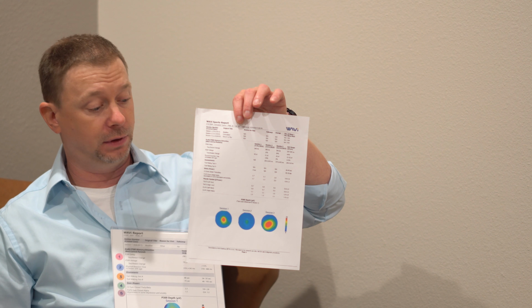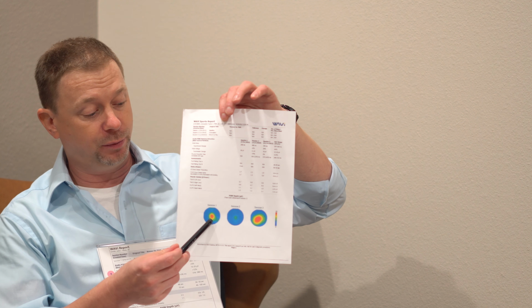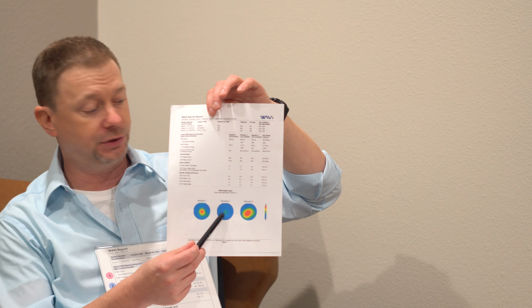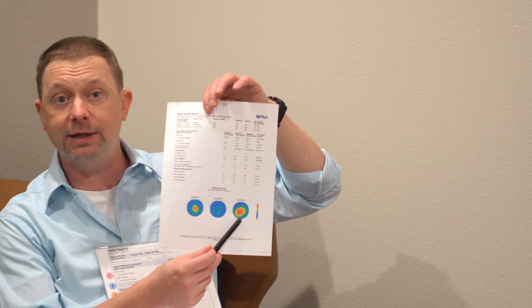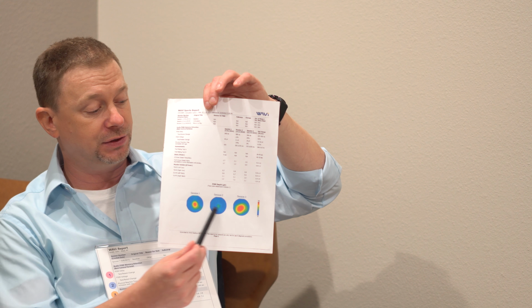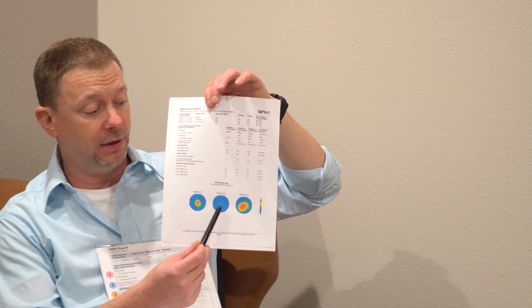I think, Nick, you might have one in your stack there. Yeah, this one. This shows an example of multiple readings showing the initial baseline where the patient is okay, then lowered activity because they've had a concussion, and then return to play because their brain's back to normal. So it's a pictorial representation that shows the patient healed and is doing better after having had a problem.